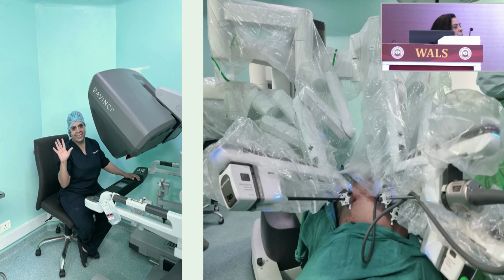Here you can see how happily I am sitting on the console. So robo doesn't do the surgery. Actually, we are doing surgery and we are using the robo arm, and I call this console a very happy console. This is something dream come true for the surgeon. You sit happily over here because this is not a simple console. This is an ergonomically designed console where you can see high definition 3D vision, and you control the laparoscopic instruments which are mounted on the robo arm with the master control and the foot pedals, and the precision is so much that you can dissect very delicate tissue in a highly precise manner.